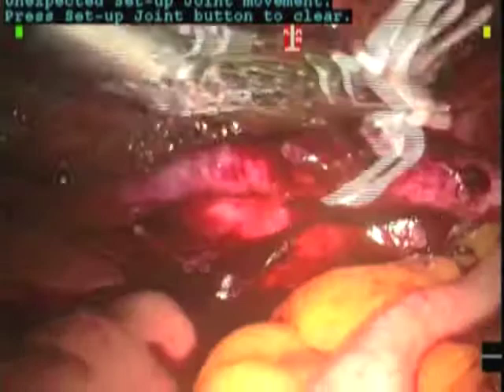Here we see the distal ureter completely freed up, the mid ureter completely freed, and the proximal ureter completely freed.